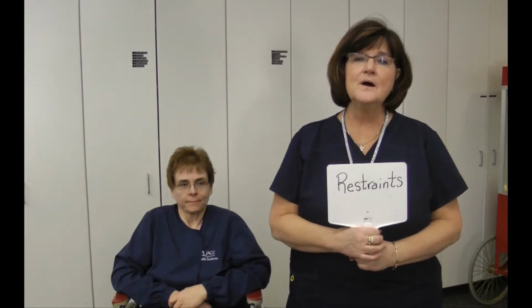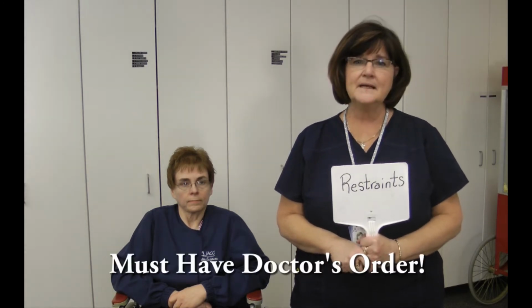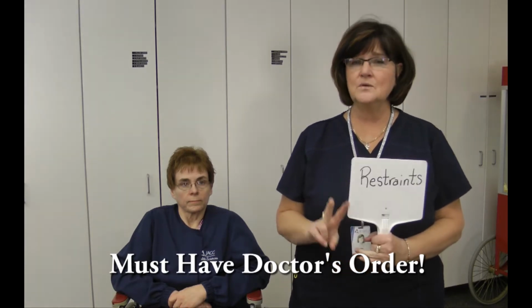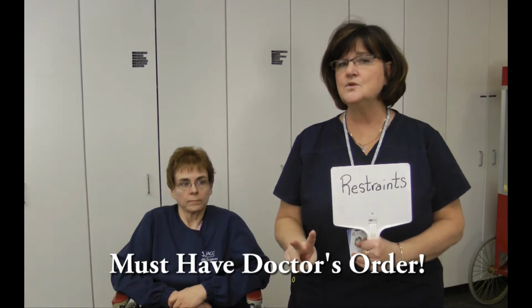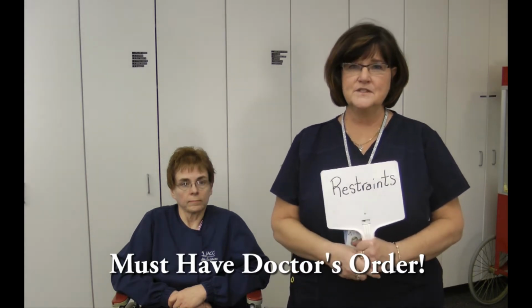Right, today we're going to learn about restraints. I want you to know that restraints are illegal in the nursing home unless a doctor orders them. They can only be used for the protection of the resident, them hurting themselves or them hurting someone else. Again, restraints cannot be applied unless a doctor specifically orders them, and there's usually only two kinds of restraints that we can use. One is called a waist restraint and one is called a vest restraint.